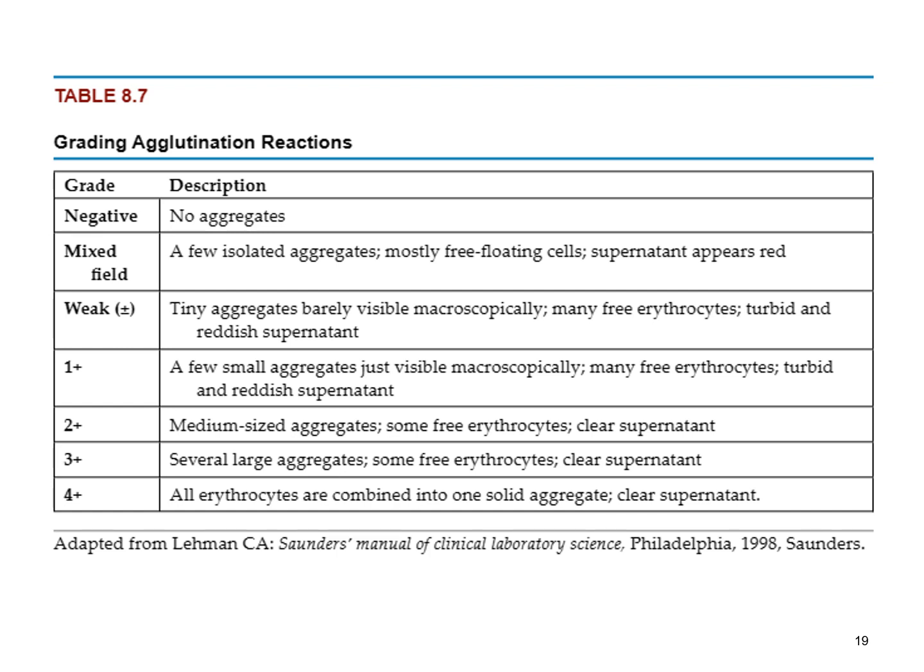A negative reaction, of course, is just you have no agglutination taking place. Mixed field reactions means you have a mix between a positive and a negative reaction. A weak reaction is just going to be that you have some very tiny stuff that's happening. A lot of times you have to refer to the microscope to confirm that you're actually seeing these reactions take place.